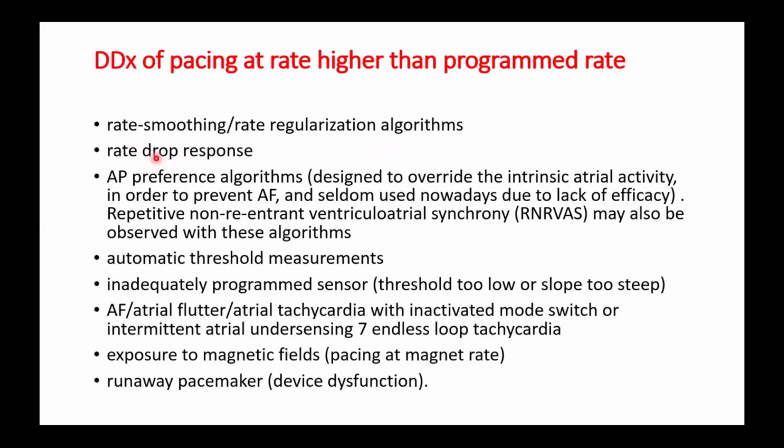When a sudden drop of a certain number of beats occurs, it paces at a higher rate for an intervention duration, usually pacing in DDD mode at a rate of 100 for 2 minutes.